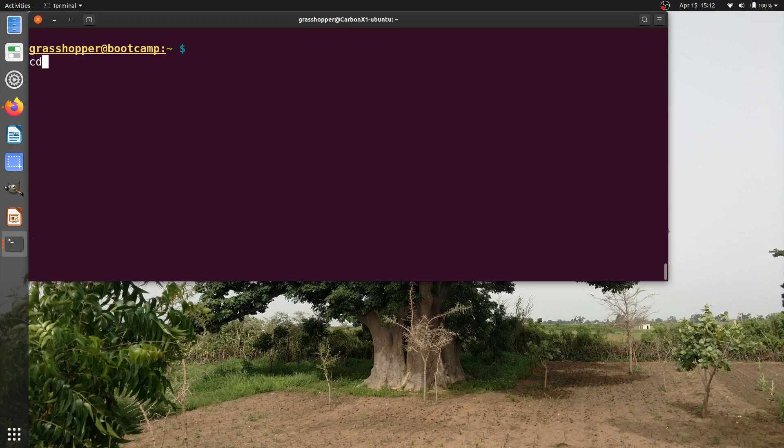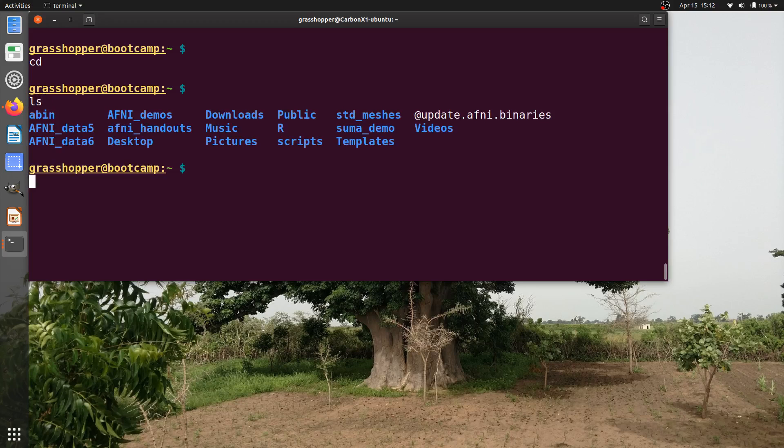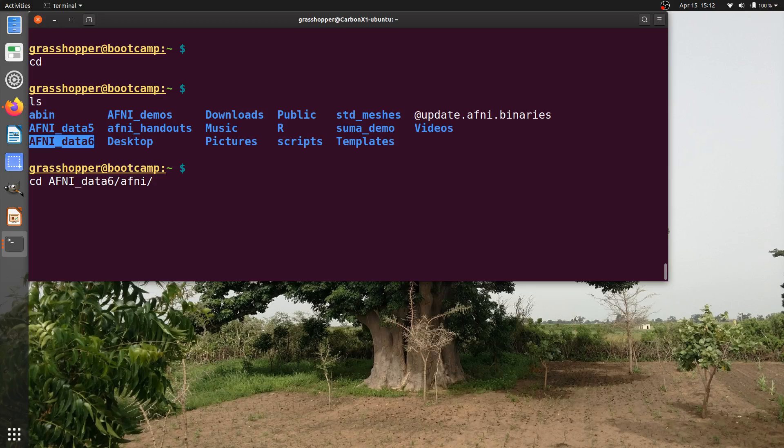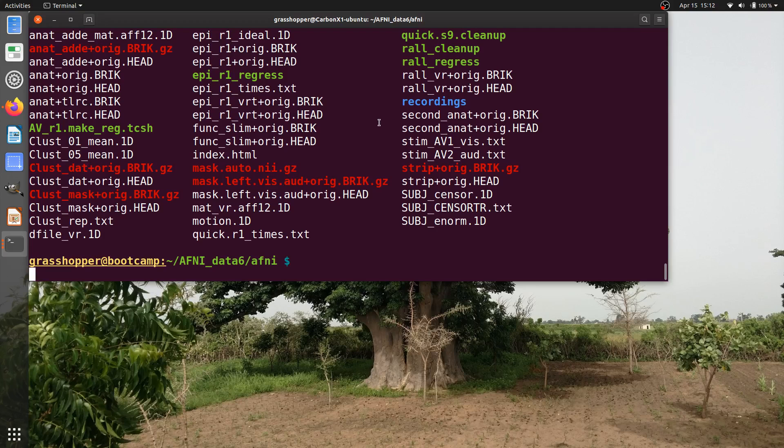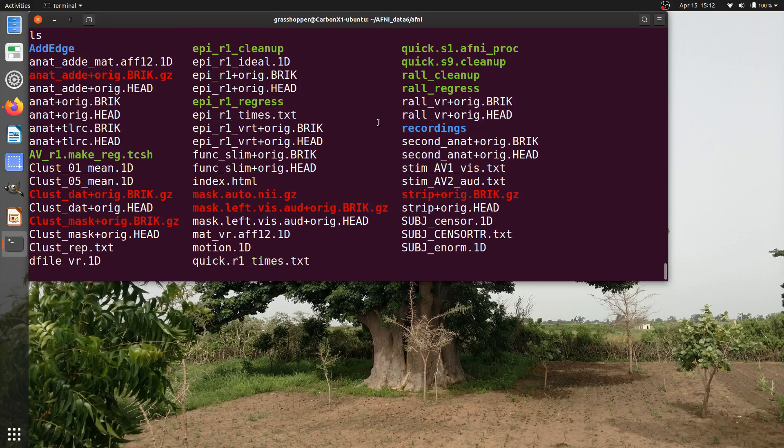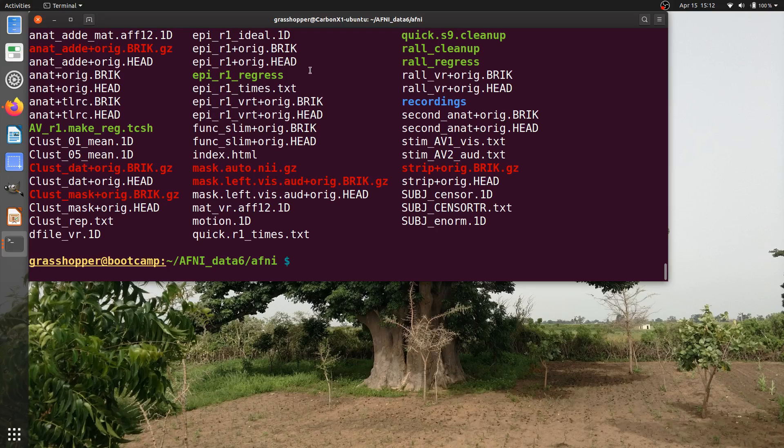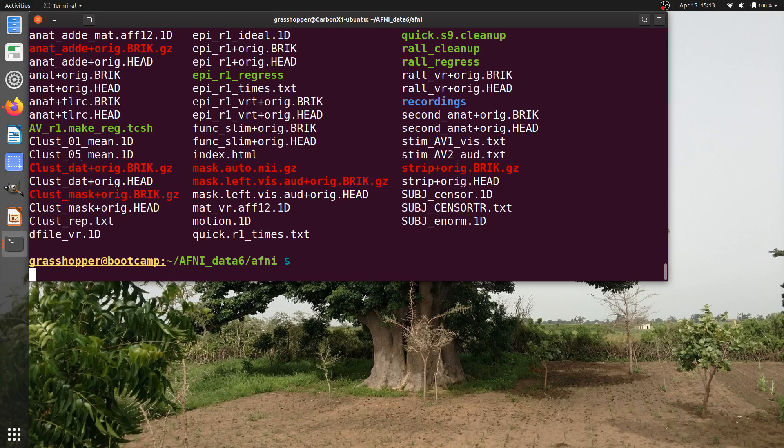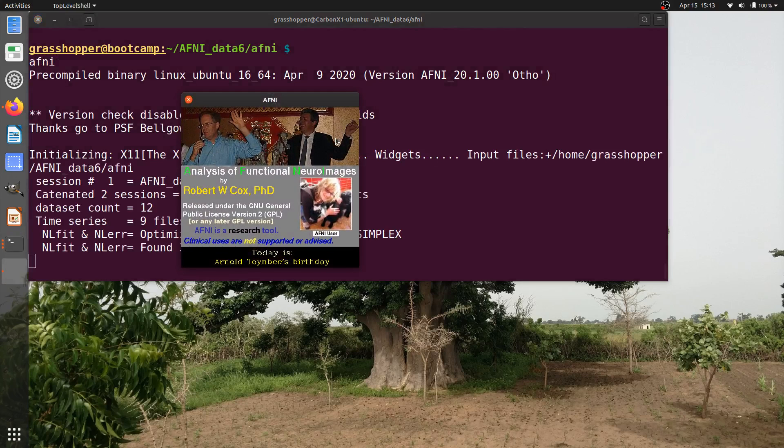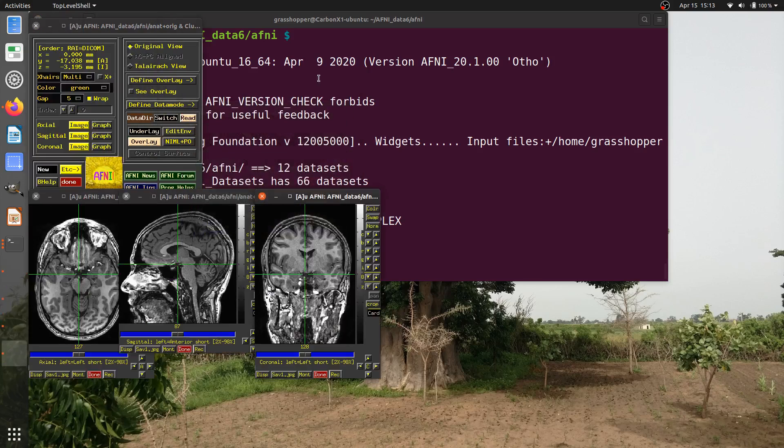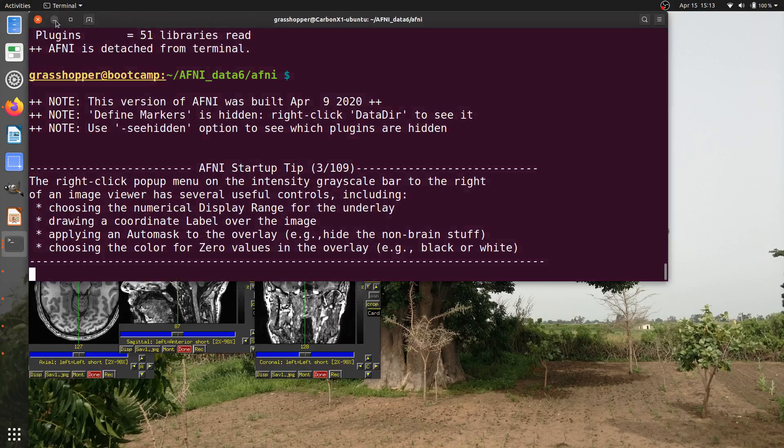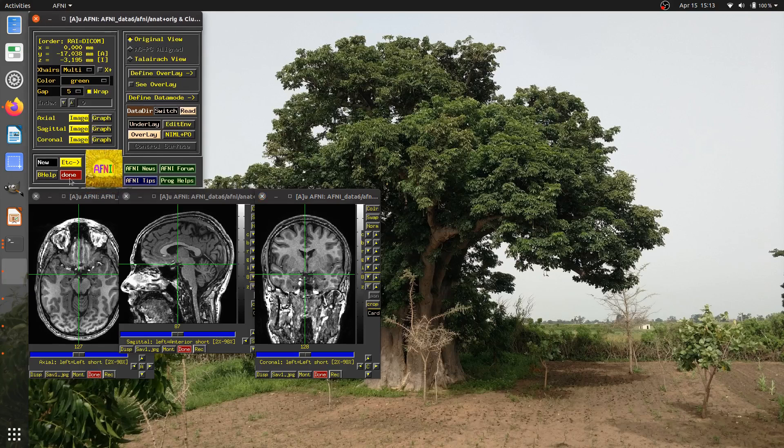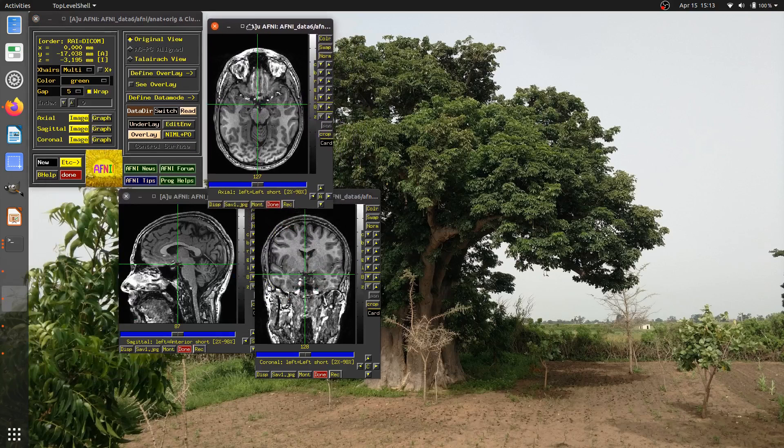So here I have my terminal, and I'm in my home directory. If I type ls, I see that I'm set up for the bootcamp, so I'm going to change into this directory AFNI data six, and actually the AFNI directory there. So I'm going to run AFNI to open up the GUI, and I'm going to close my terminal in the background just for the sake of space.